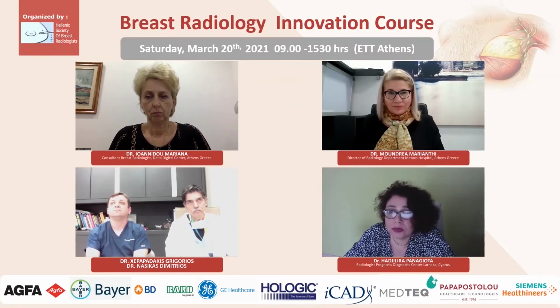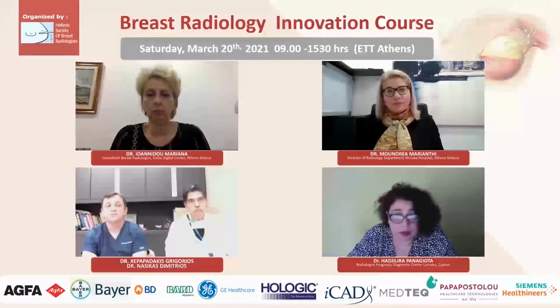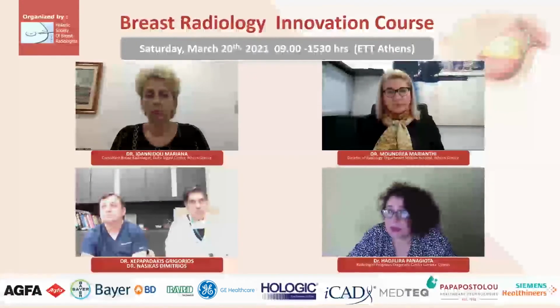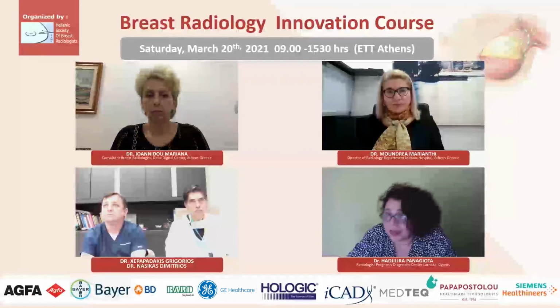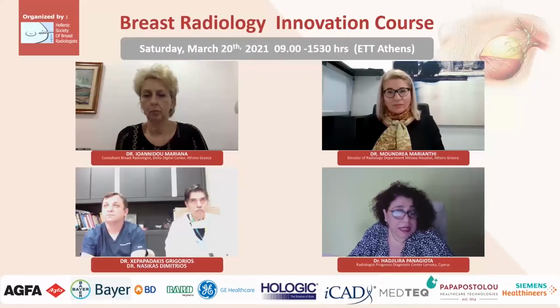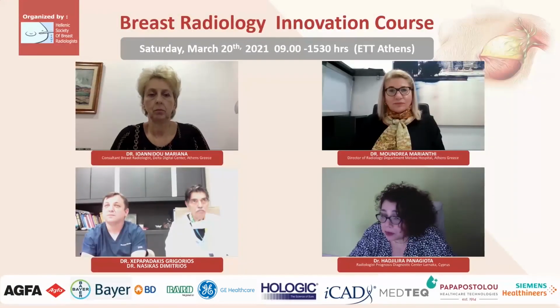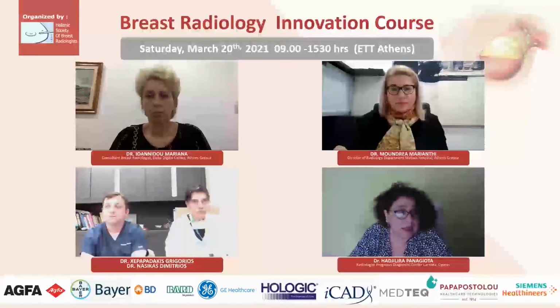I would like to say for a start that the ultimate goal for everybody involved, breast surgeon and radiologist, is the patient. And from that perspective, any tool or weapon that provides us with the opportunity or the means for a better outcome for the patient is both needed and welcome. Therefore, it's very interesting to witness the advances of contrast-enhanced mammography. Studies have shown that it performs similarly to MRI in cancer detection and tumor size estimation, and of course, monitoring treatment response.